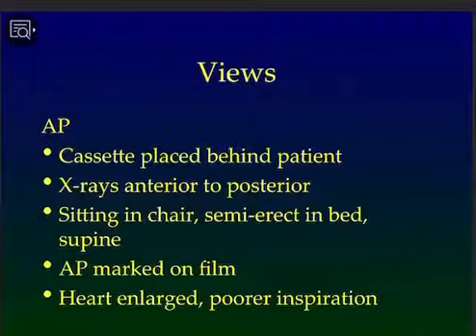Okay. So this is the advantage, that it can be done in multiple positions, so those patients who are very sick, very ill, who cannot stand properly, cannot assume a proper position, in those patients you can do an AP view. Even those patients who are bedridden, who are hospitalized, you can do an AP view.